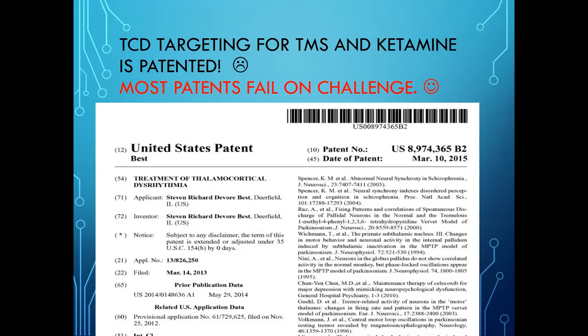What they patented was not using a DSM to target the TMS, but using the thalamocortical dysrhythmia to point the magnet. So if you see a dysrhythmia in the auditory cortex, as Dirk does experimentally before he implants a stimulator to turn off tinnitus more permanently, he'll pulse TMS and see if it influences the intensity of the auditory tinnitus. If it reduces it even very briefly, it's a strong indication that the implant will end up working. So you can use the dysrhythmia to target the TMS and point it at the appropriate cortical location for pain, movement disorders, depression, etc. And obviously at the frontal midline for people that have the reward deficiency syndromes.